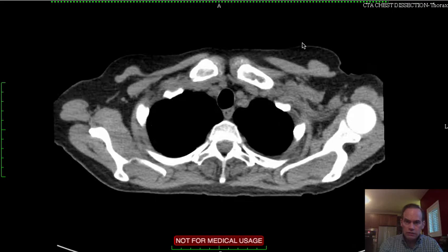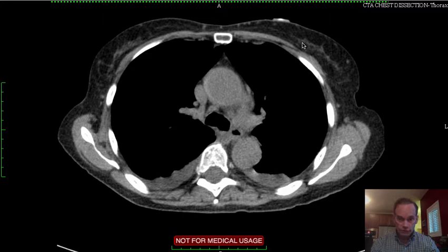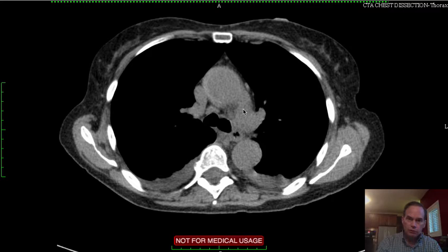IV contrast enhanced images also were obtained. Now when we start from the top down, see if something catches your eye. If anything looks abnormal there — that's very good if you can detect this relatively subtle abnormality here. The abnormality is this crescentic high attenuation that is between 50 and 60 Hounsfield units. You don't see anything like that in the perimeter of other vessels or in the descending aorta. This is the ascending aorta.